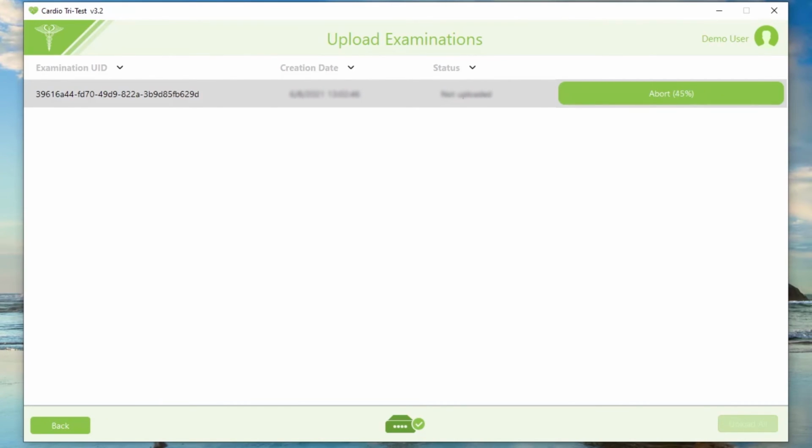This completes the testing. In the following video, you will see how a GP or cardiologist can access the processed results.